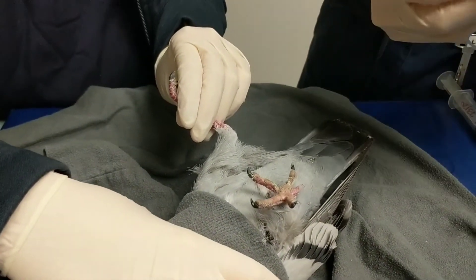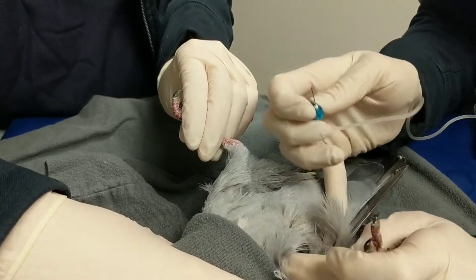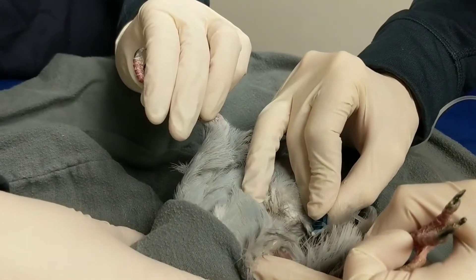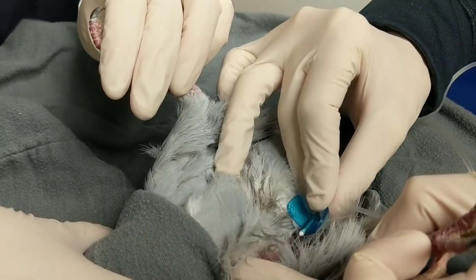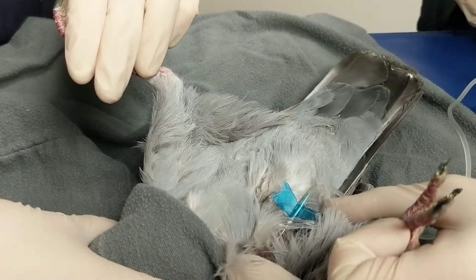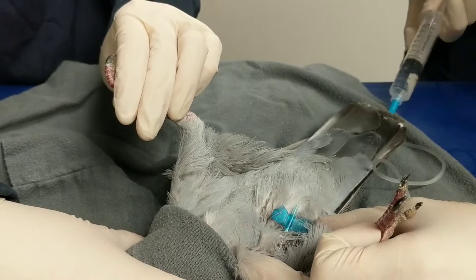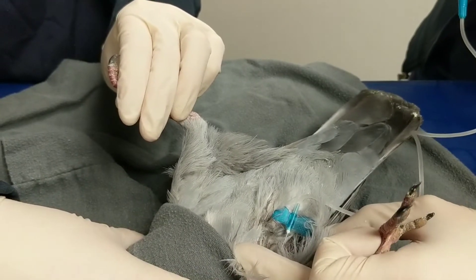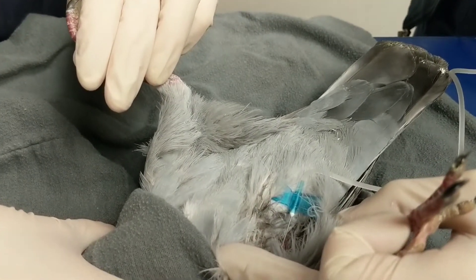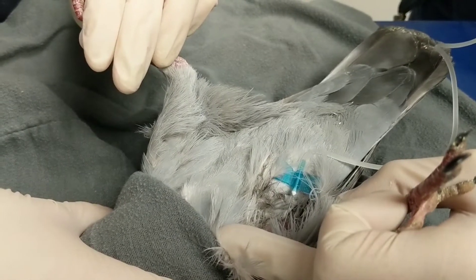So I'm going to take the butterfly. I'm just going to hold the leg and hope this goes smoothly. The bird's skin is really thin, so it's quite easy to go through and through. I'm going to do half of the volume into each leg. I'm drawing back to make sure I'm not through — I'm in the right place. I'm looking for negative pressure, which I'm getting. So I'm going to go ahead and start administering it, and then you should be able to see it starts to form a bleb — a little pocket of fluid there. Perfect.